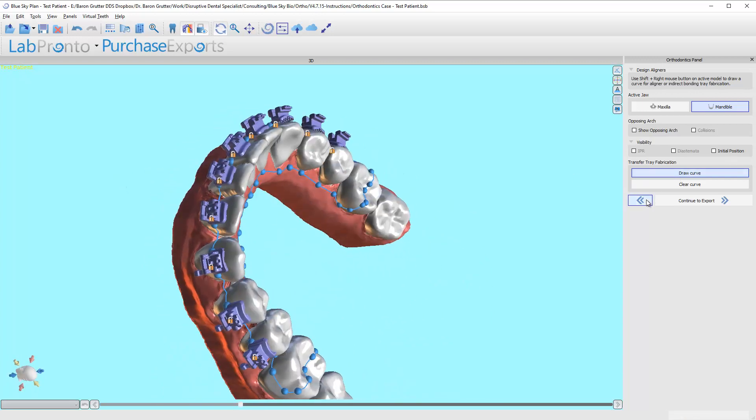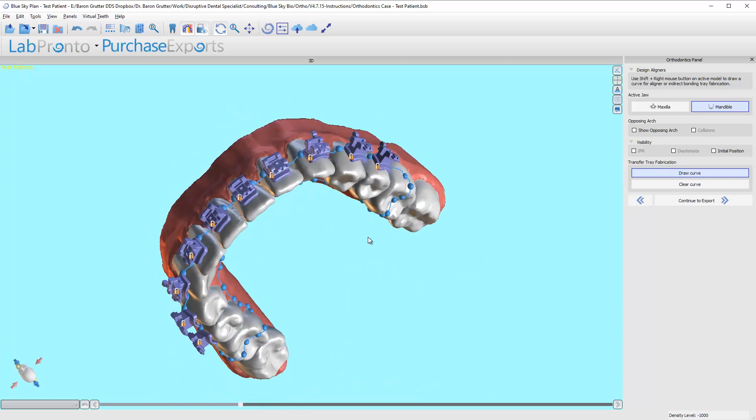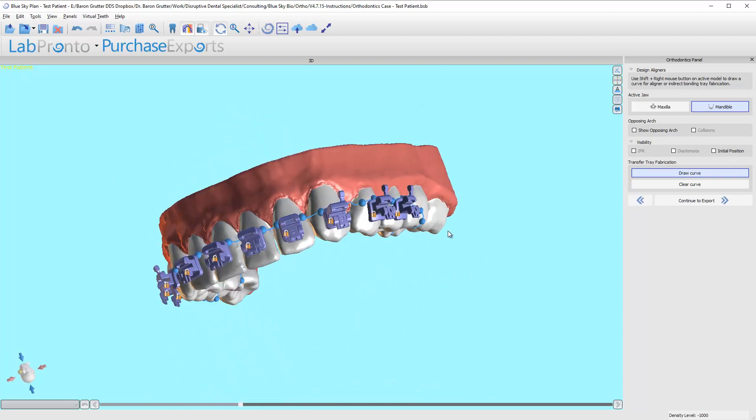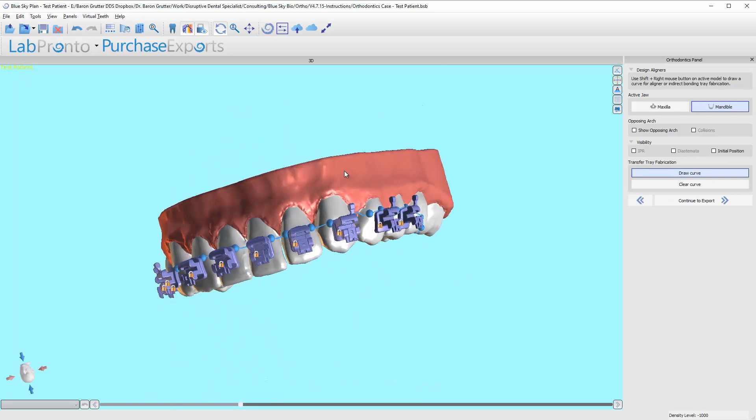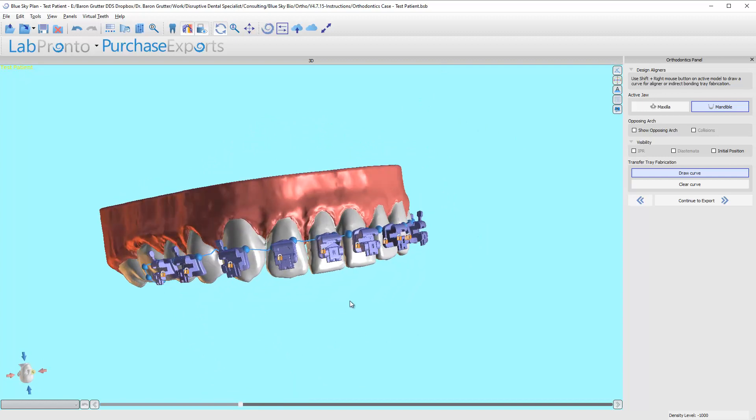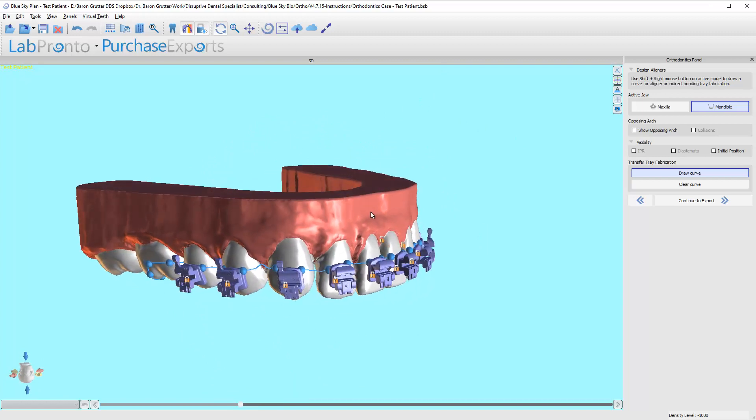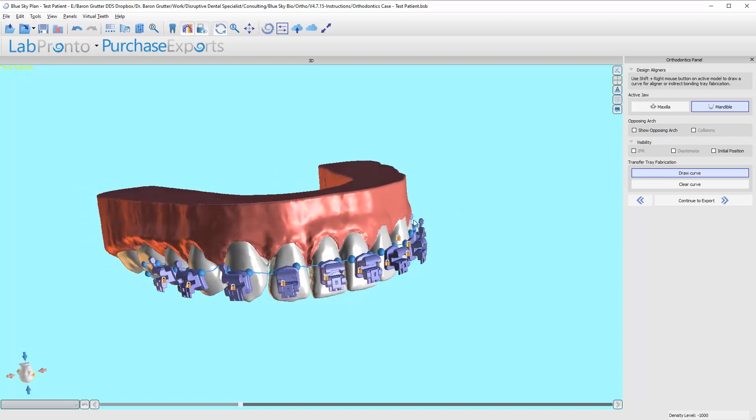Now I can continue to export. At this point, it's going to run calculations designing the actual tray. This is a little bit of a time-intense process as it's making this creation, so grab a cup of coffee.